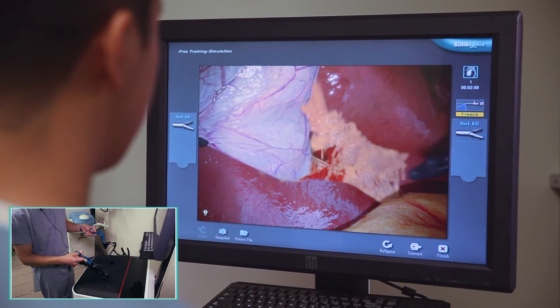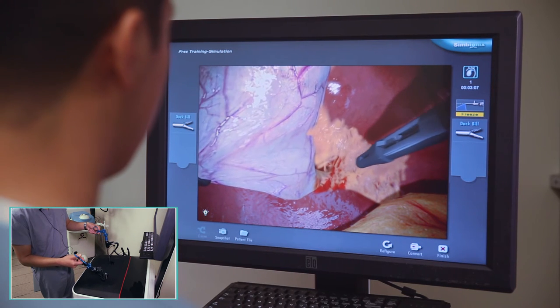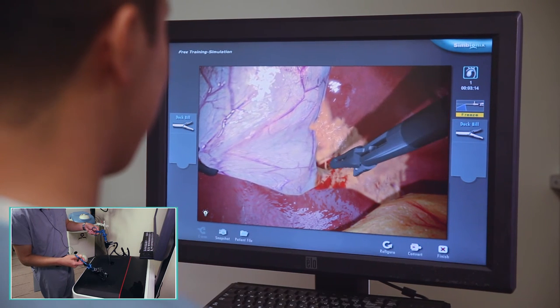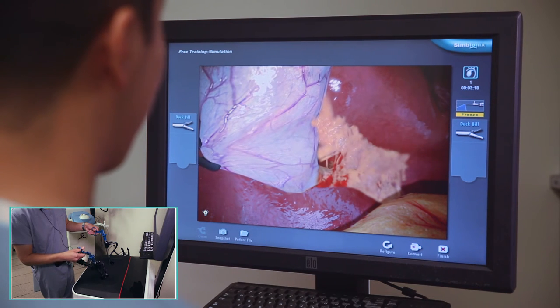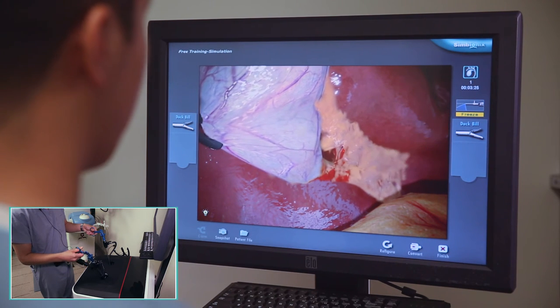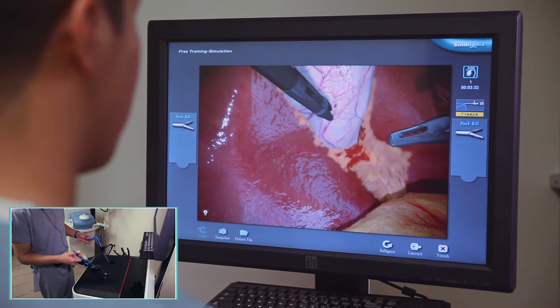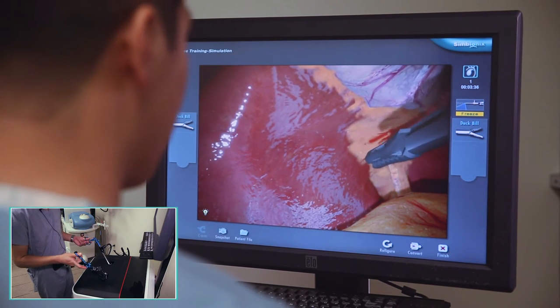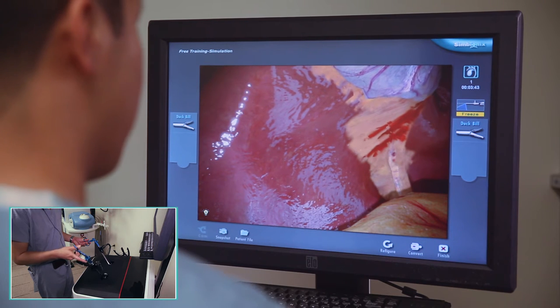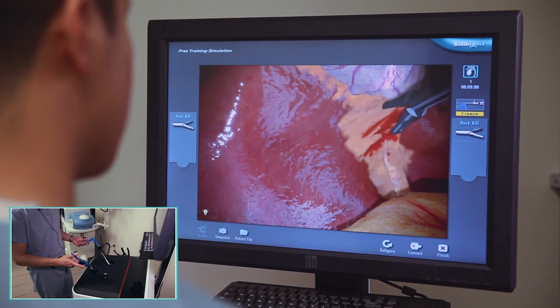When you're doing this, don't ever be afraid to let go and re-grab with your retracting hand — in this case my left hand — if you can't quite see what you're working on. The adhesions are turning a little bit bloody, which is what they're going to look like. But what I'm crucially not seeing is any streams of blood flowing downwards, which would be a venous bleeder, or any pulsating arcs of blood, which would represent arterial bleeders. I'm going to re-grab here and push the gallbladder over to the other side. This allows me to expose the back of the triangle of Callot. I'll take down some adhesions here, remembering to always proceed from known to unknown, staying close to the cystic duct.